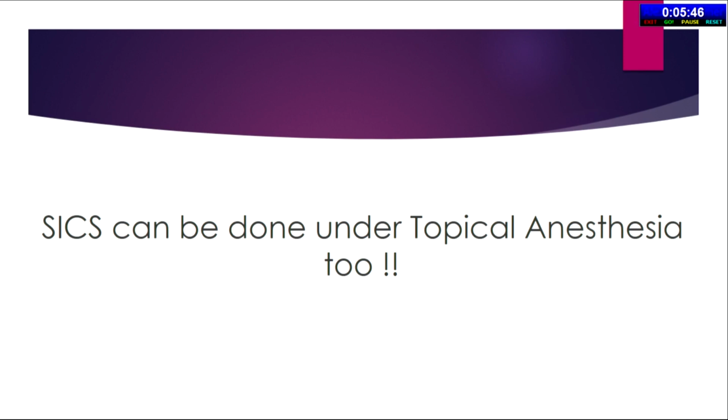As everyone is agreeing now that it can be done topically, I am doing topical SICS since last 5 to 6 years. No problem at all. Even you can do cautery in that. Patient does not feel pain. The block is at the surgeon's mind. It does not be required at the patient's eye. So now let's have a look at a video.